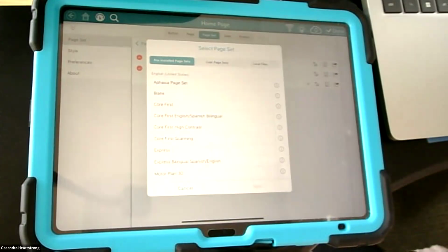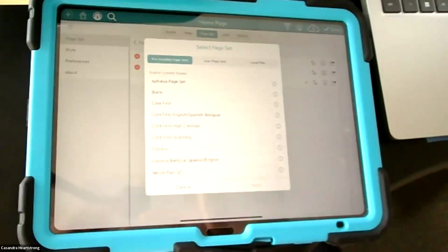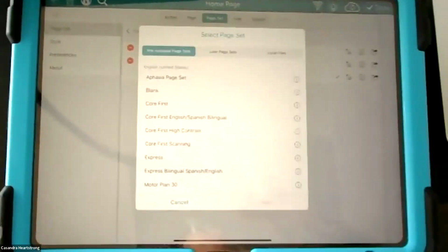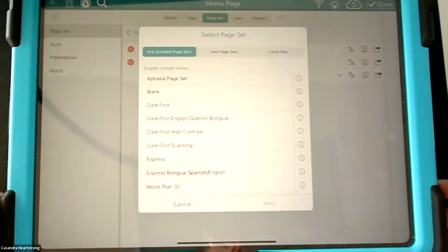Sorry, going back to the QWERTY keyboard, when I was in one of our preschool classrooms today, I went to the keyboard and it had QWERTY, and so I hope I didn't mess them up because I made a button for the alphabet because our kids actually learn it A, B, C, D, in order. And I made an alphabet button to link to A, B, C, D in order. Is that okay? Yeah, that's great. Sure. Thank you.